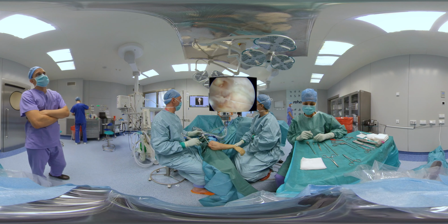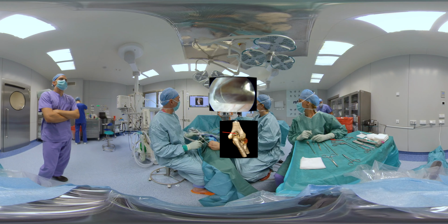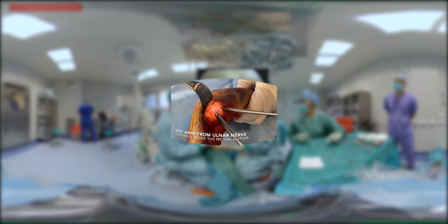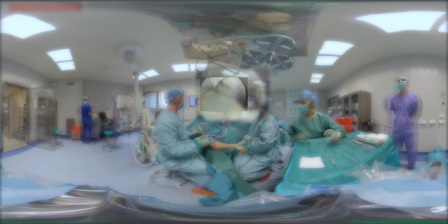Once the inflammatory tissues and capsule are partially removed and working space is created, more loose bodies can be found. Both scope and shaver need to be kept away from the ulnar nerve, not crossing posteromedial capsule and staying within the medial gutter.